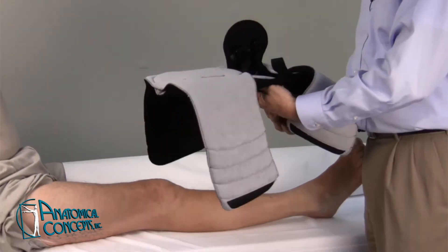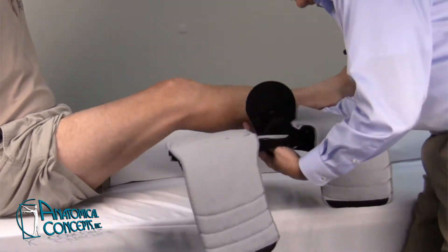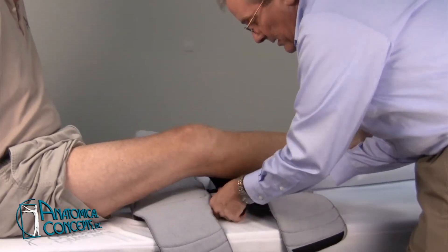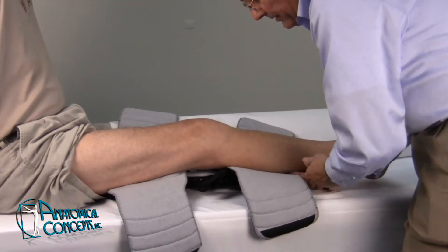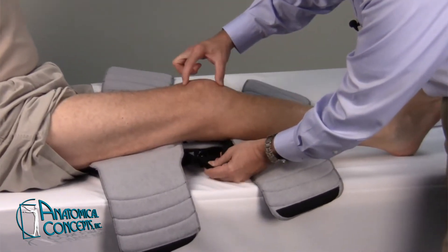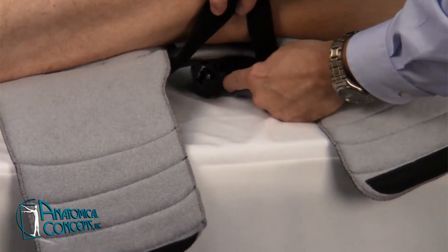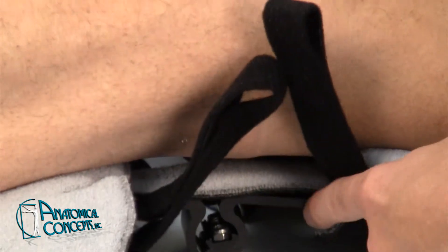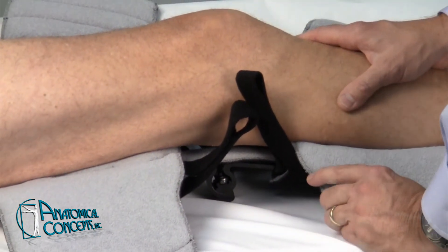Being a single posterior upright design, the patient is typically lying in bed. You can go ahead and raise the patient's leg up gently, place the device underneath the patient's extremity, and try to center it so that the upright is midline posterior. Additionally, you want to line up the center of the patient's actual knee joint — the bending point — with the center, which is this round area here.